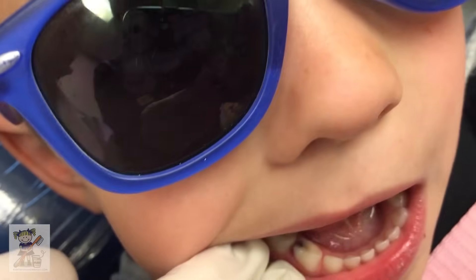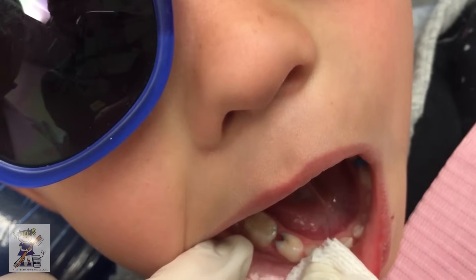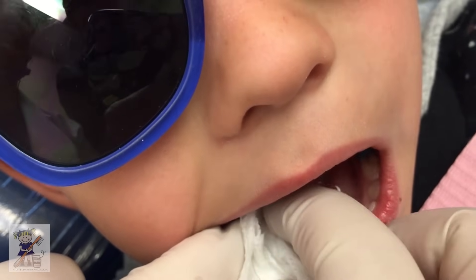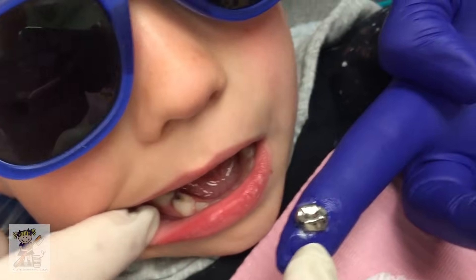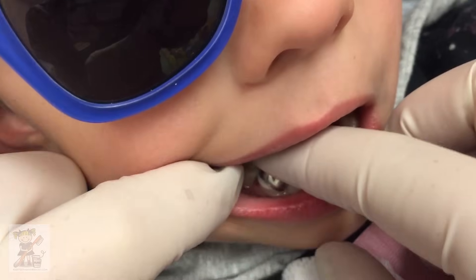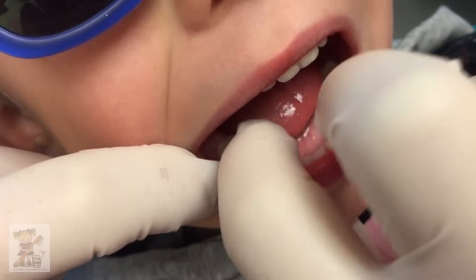We did a smart filling on the adjacent tooth — Spider-Man, excuse me, his Spider-Man crown. You can see the smart filling on the adjacent tooth. Mom's doing an awesome job with his diet and hygiene. Look how clean his teeth are. He's the best. And here's our Fuji Cem 2 filled stainless steel crown, filled to the brim with goodness. If he was more uncooperative, I would put a 4x4 in the back of his mouth.